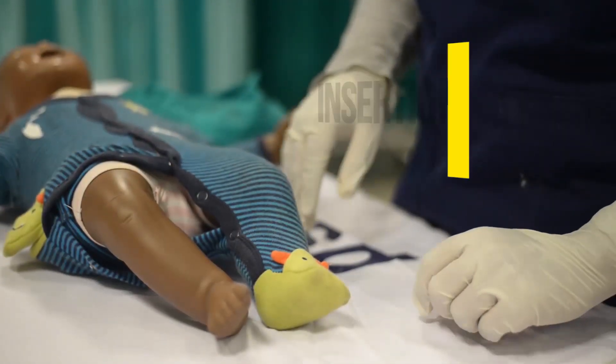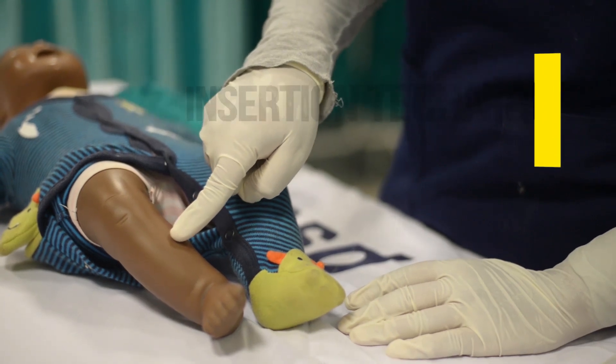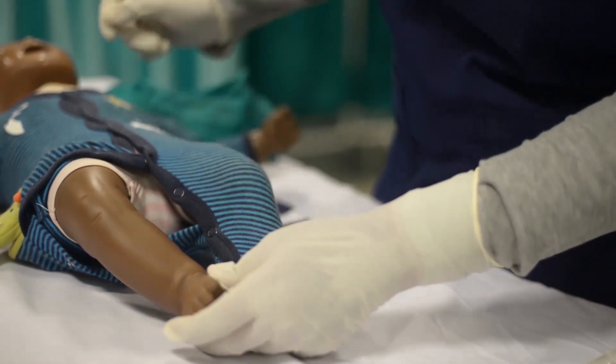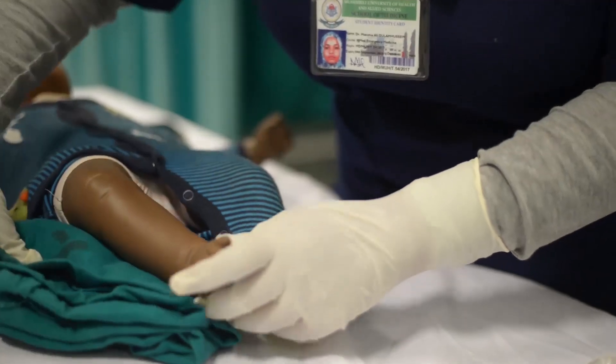Insertion techniques: identify the site for puncture — the flat, anteromedial surface of the tibia, 1–2 finger breadths below the level of the tibial tuberosity. Position the leg with the knee slightly bent and semi-externally rotated. Place a sandbag or towel roll under the leg for support.